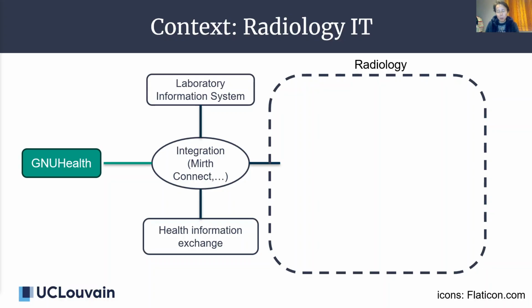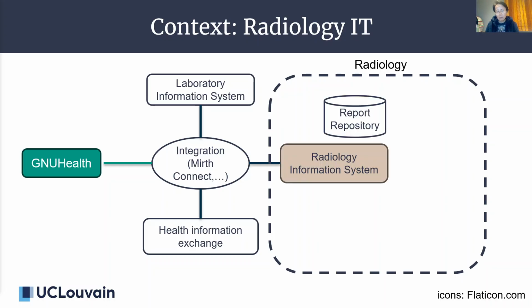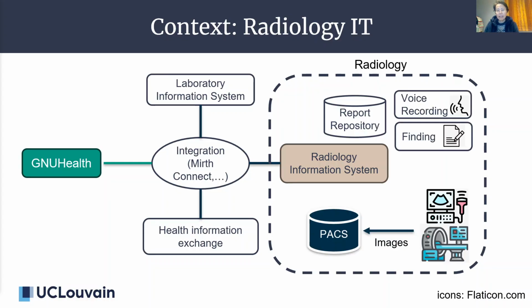One important system is the radiology information system, the report repository, which stores the diagnostic results, such as from voice recorders, doctor findings, and critical results, and the PACS system, such as the Orthanc PACS system, a picture archiving and communication system, is the electronic management of the storage, retrieval, distribution, and presentation of medical images.